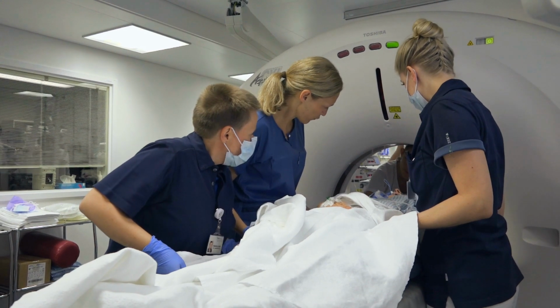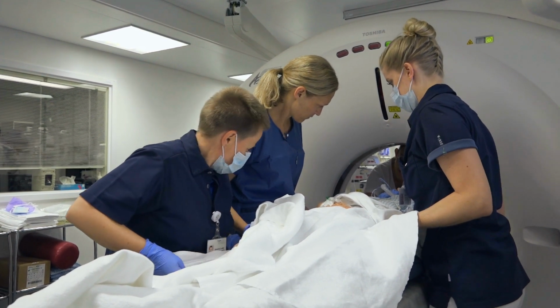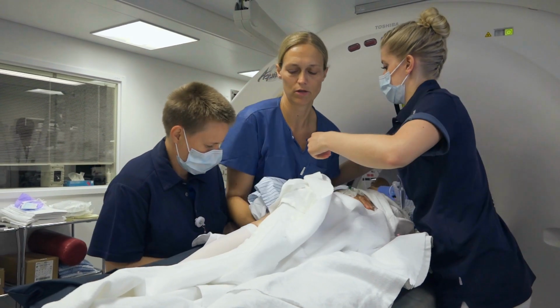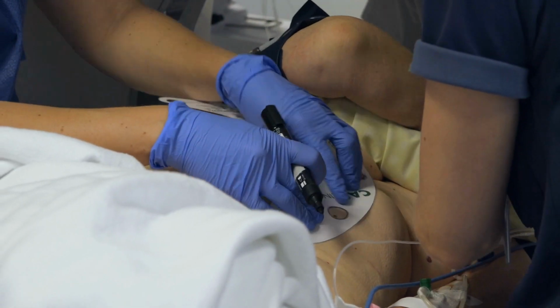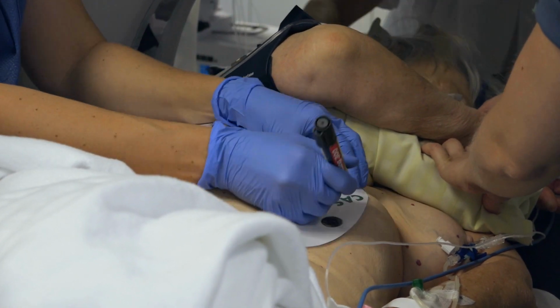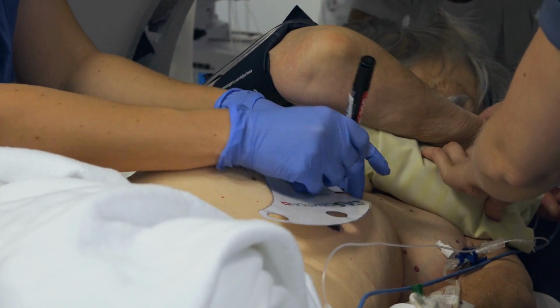The patient is placed in a 45-degree left lateral position on a vacuum mattress so that the right upper abdomen and thorax is exposed. The marker position is chosen according to the pre-planned axis direction and marked on the patient with the help of this template.